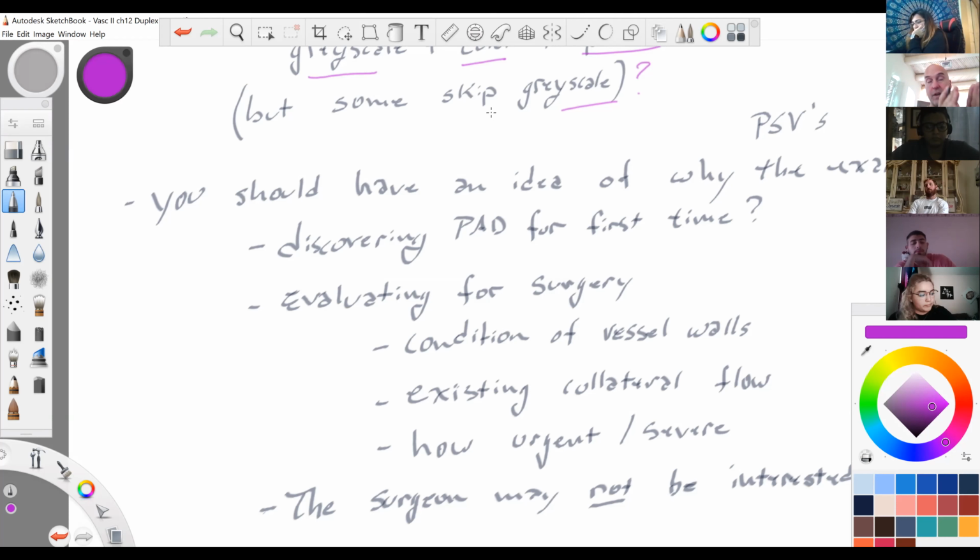Now, if you have someone who's very diseased, you're going to be inching your way through because you're going to want to find everything that's going on. And typically, people don't just have one location of plaque. It's a distribution, and you need to look at all of them.